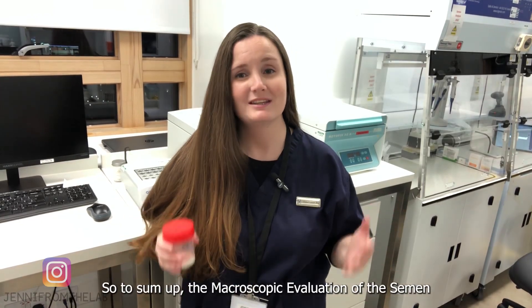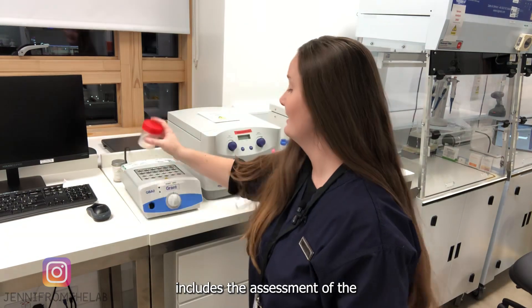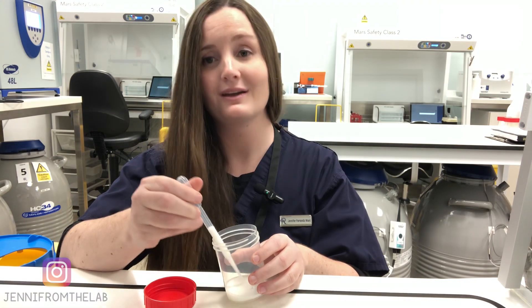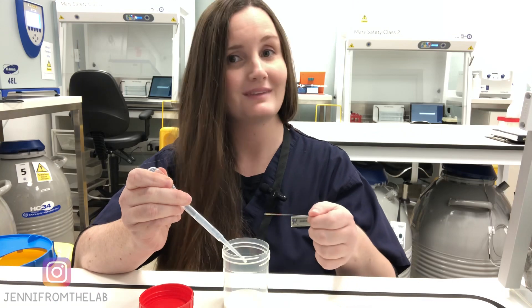To sum up, the macroscopic evaluation of the semen includes the assessment of liquefaction, appearance, odor, volume, viscosity, and pH.